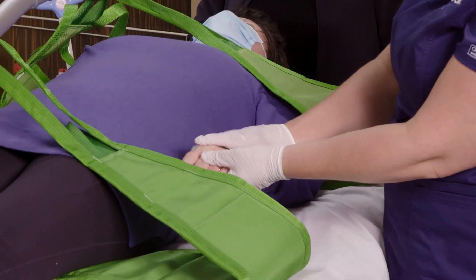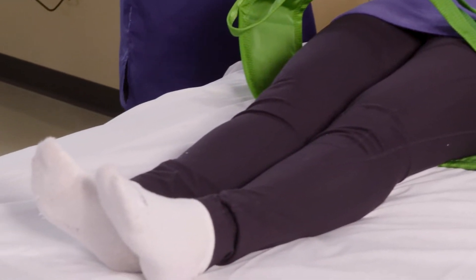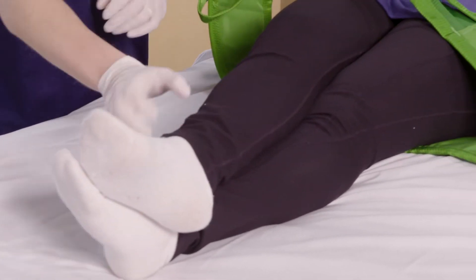Before turning the patient, we're going to tuck the patient's hand under on the side toward which she's going to turn, and we're going to cross the leg over on the opposite side toward the side she's going to turn.